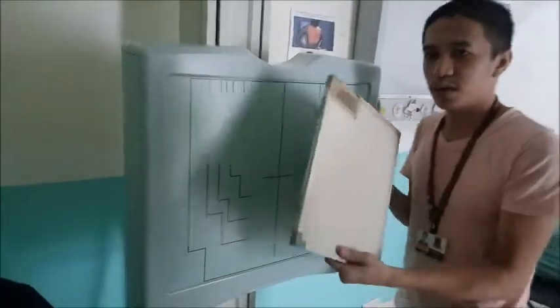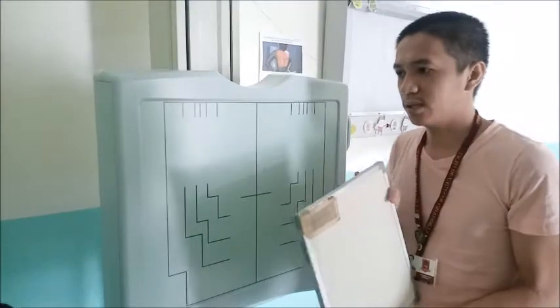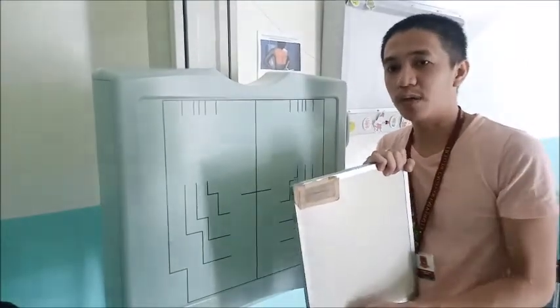So 10 by 12 nga cassette. Tapos ang ato ang examination is an apicolordotic view. That means that is an AP axial projection, naka-AP si patient.